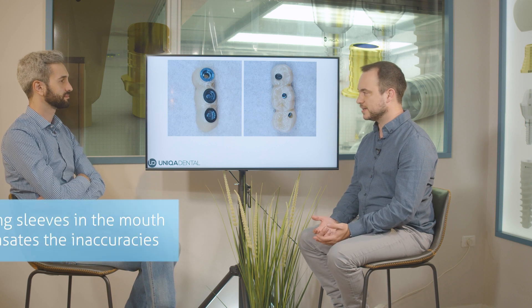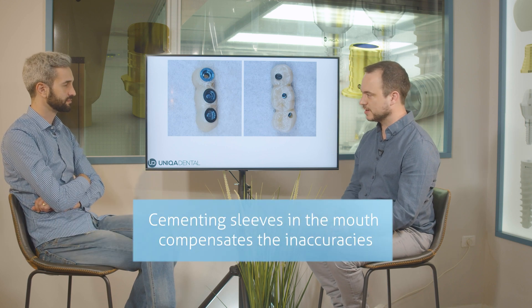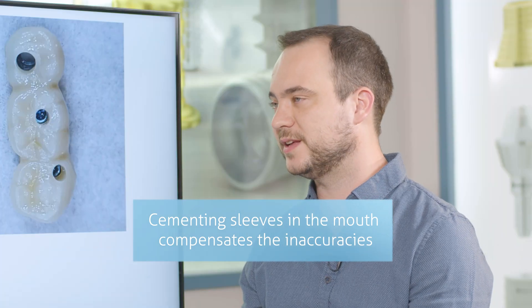This is probably leftover cement, because the cementation of the sleeves is done in the mouth — to compensate for inaccuracies from scanning, manufacturing, and sintering processes. When you cement the sleeves inside the mouth, you then take out the bridge and clean them outside, so there won't be any leftover cementation.